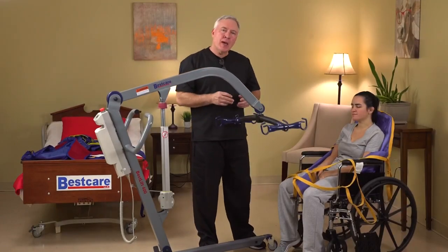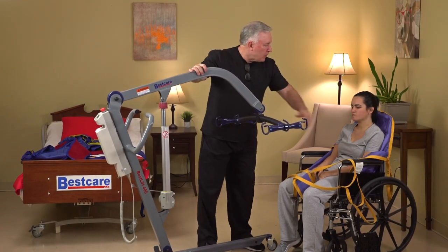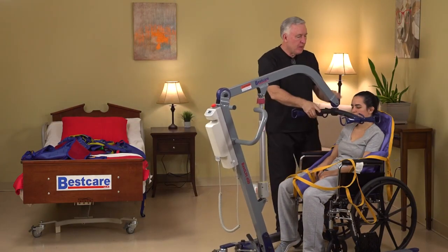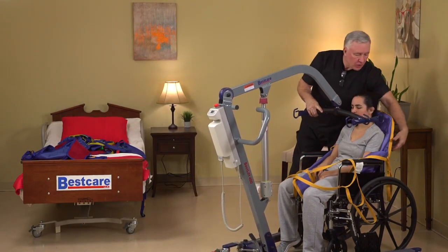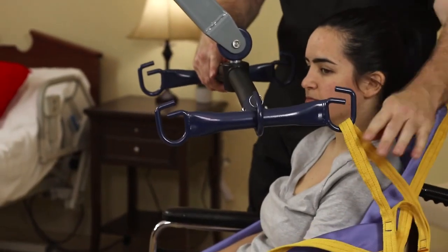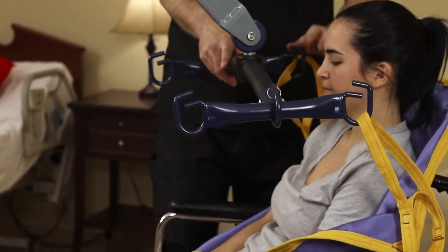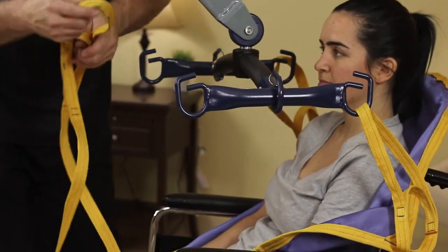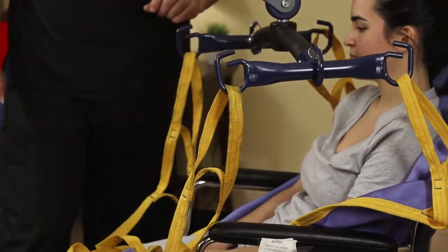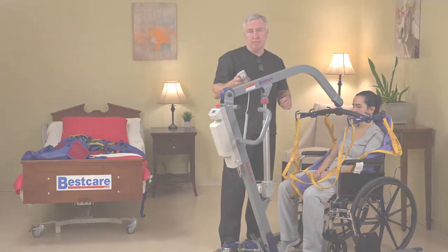Now it's time for me to show you how to hook up the 4-point sling to the 6-point spreader bar. So our 4-point sling is in position on the patient. We approach with our 6-point spreader bar. And with our non-rotating hooks, it's very simple to understand that we connect the shoulder loops to the first set of hooks, and the leg loops to the hooks closest to the lift. And now we can raise the patient up with the 4-point loop sling.